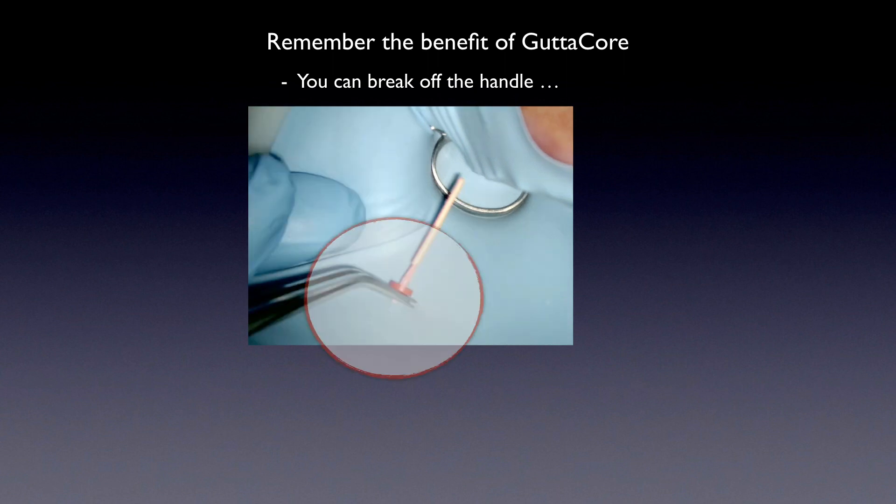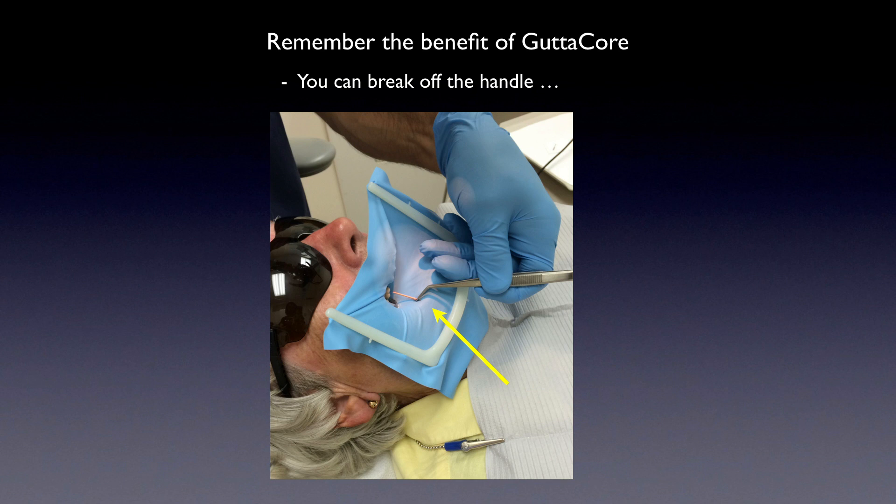With the handle removed and cotton pliers in hand, everything is easier — visibility, handling, access. Please, just break off that handle. It's a phenomenal feature because not all carrier-based systems on the market allow you to do this. Look at this upper molar case where the patient can't open their mouth much — see how easily I fit the carrier into the tooth with the opposing arch close by. Not every patient can open wide, and you shouldn't have to abandon an obturation just because of limited access.